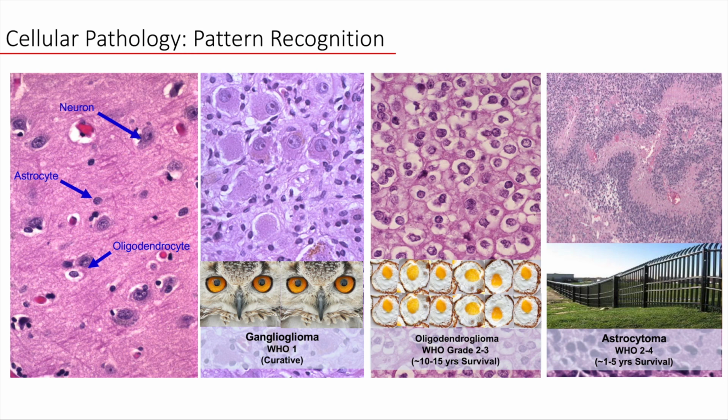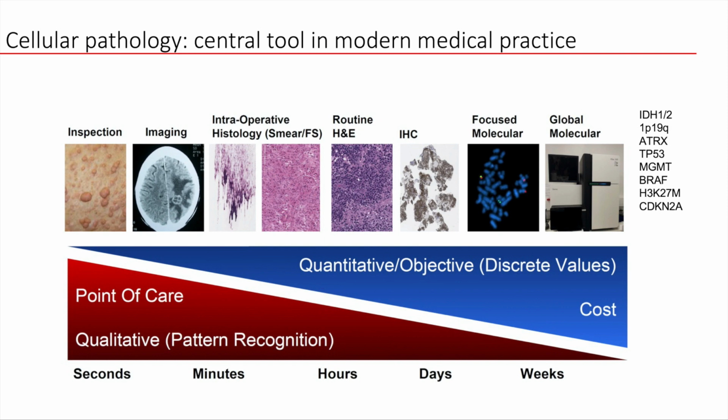When we see these in tumors, they suggest a relatively aggressive phenotype, and thus patients with these are enough to grade the patient a WHO grade 4, which has a much more guarded prognosis for the patient. So a very, very versatile tool, both for inter-tumor variability and also intra-tumor heterogeneity, and thus it's still a central tool in our modern medical practice.